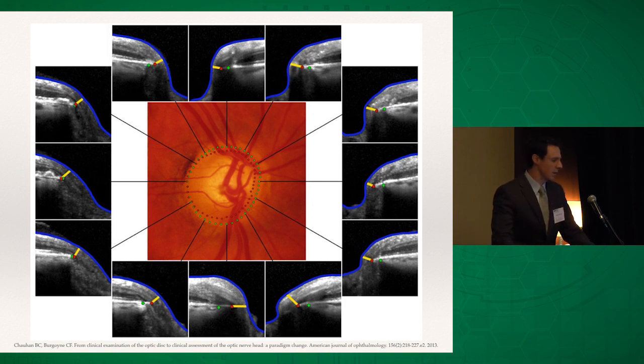And you can see in the temporal part of the disc, there's some parts where they line up pretty close and they're pretty similar, but in areas that are, in this case, susceptible to glaucoma injury, such as the superior and inferior poles, you can see that the clinician thought the disc margin was actually much wider than what the anatomical disc margin ended up delineating. So this patient would have a smaller rim than you would anticipate and more damage from glaucoma.